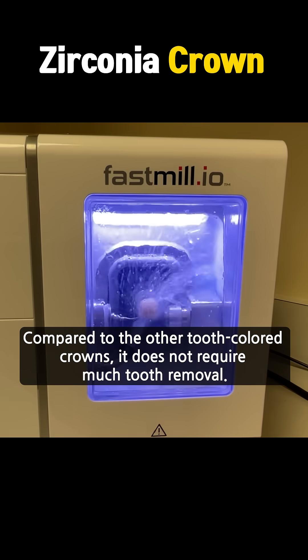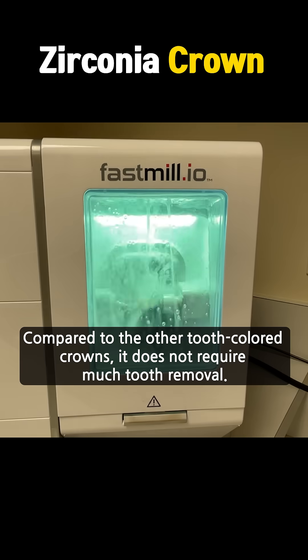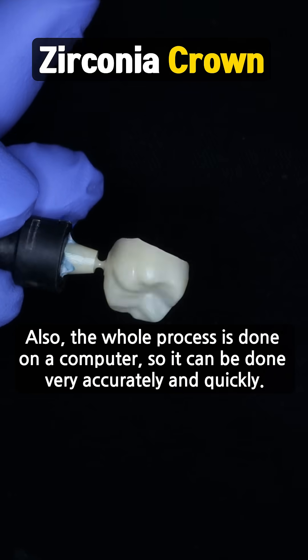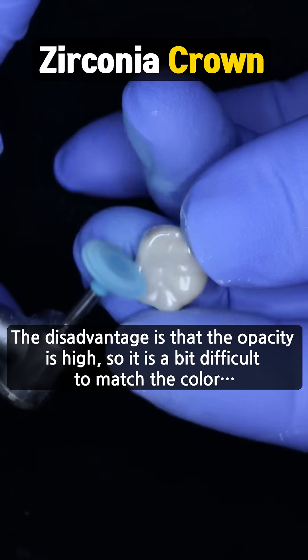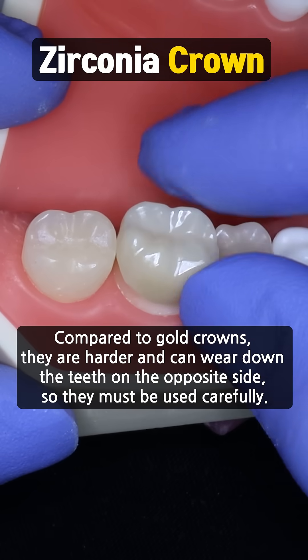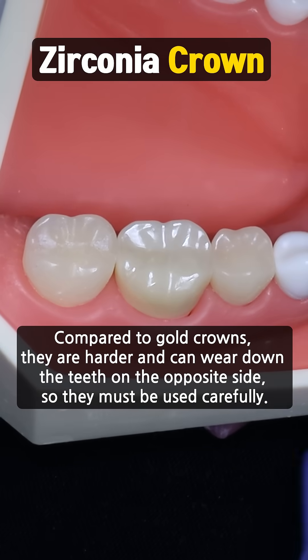Compared to other tooth-colored crowns, it does not require much tooth removal. Also, the whole process is done on a computer, so it can be done very accurately and quickly. The disadvantage is that the opacity is high, so it is a bit difficult to match the color. Compared to gold crowns, zirconia crowns are harder and can wear down the teeth on the opposite side.